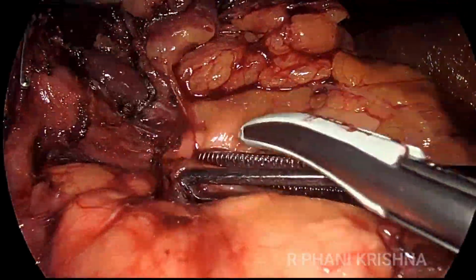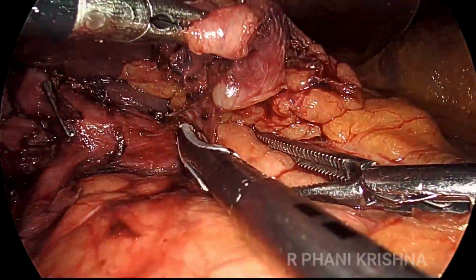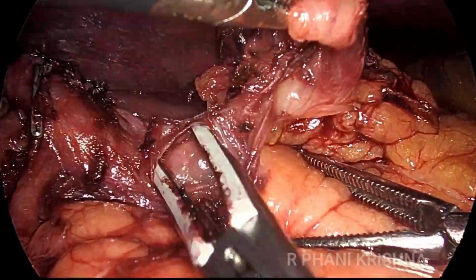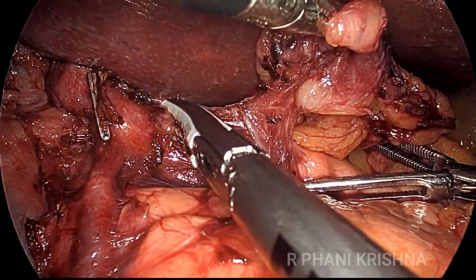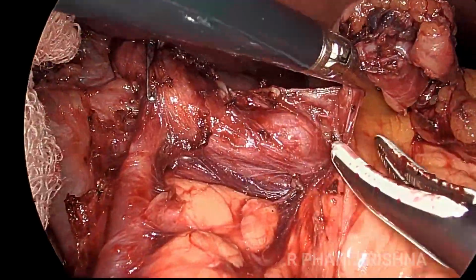Again, like I said, once the vessel is identified, the best plane and the most bloodless plane of dissection will be on the surface of the artery. We stay bang on the surface of the artery and just off the adventitia, and lift off all the fibrofatty and the lymph nodal tissue.